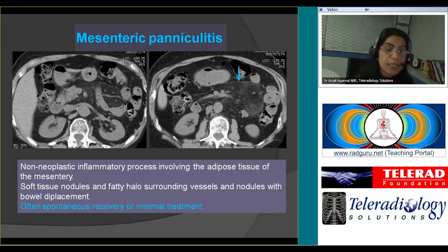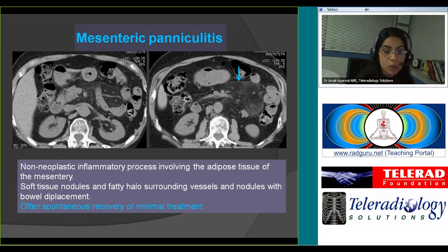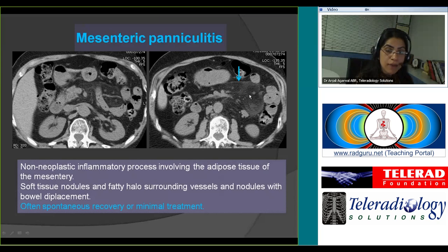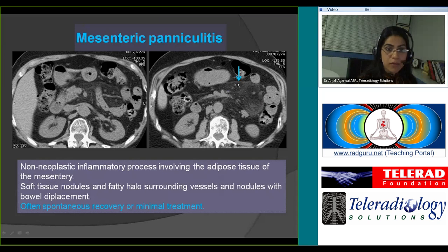Another frequently seen entity is mesenteric panniculitis, which is also a non-surgical entity with spontaneous recovery or minimal treatment. You can see fat stranding in the mesentery with soft tissue nodules that have a fatty halo, and this fatty lesion has mass effect — you'll see an ill-defined rim around it with displaced bowel loops.